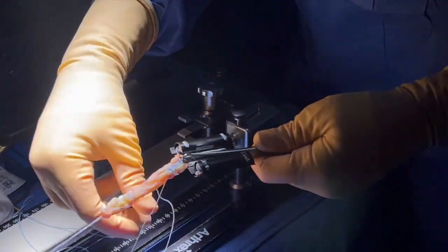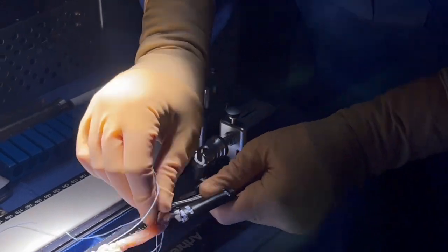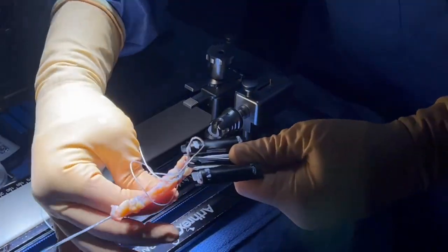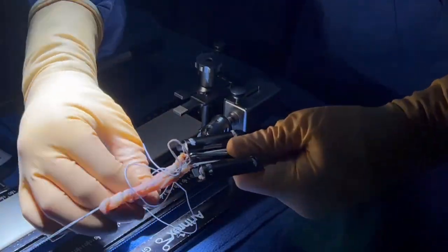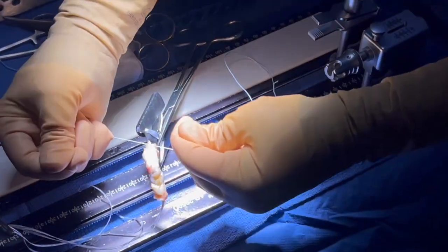The key is to make sure you avoid any tangles and take your time through this process. This new device cuts down a few extra minutes on the prep, given the internal brace is already built in and for ease of passage.